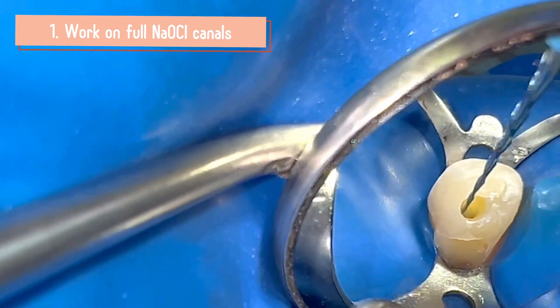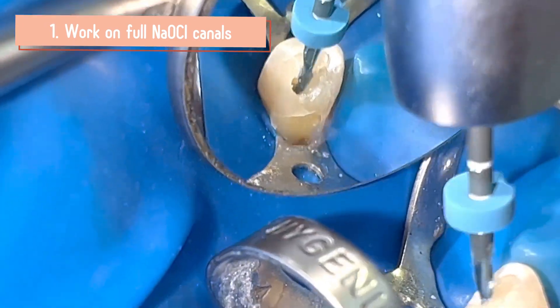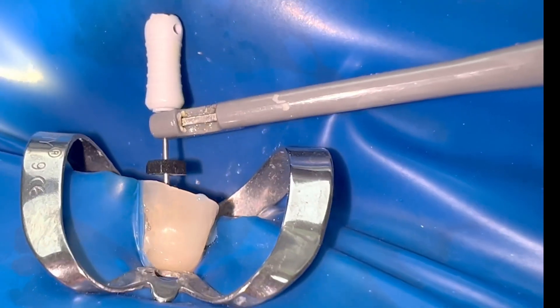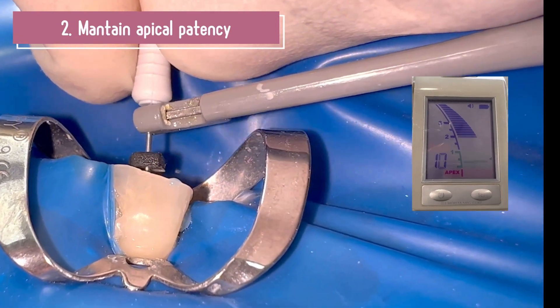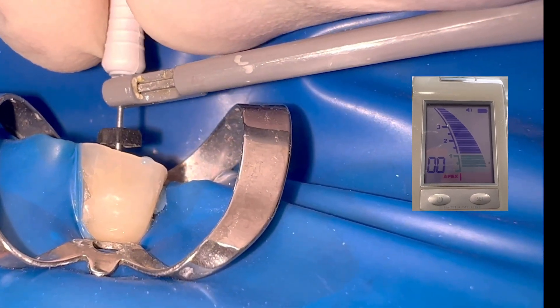It is important to work in canals filled with liquid as a lubricant, preferably sodium hypochlorite. Thus we will reduce the friction of the files and reduce the fracture due to torsion. It is important to prevent dentin debris from accumulating in the last few millimetres and causing a loss of working length or a file fracture due to blockage.